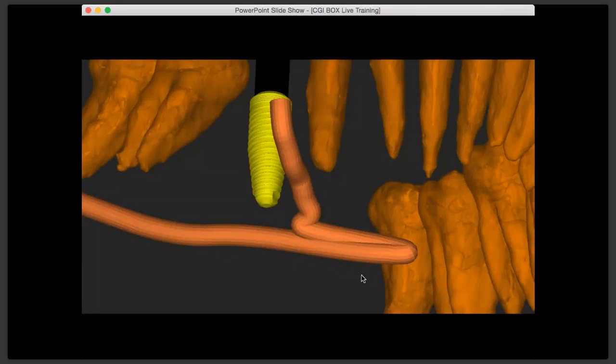Now you can study the site, you can study the anatomy. You can see that this patient has an anterior loop of the inferior alveolar nerve. Okay, so here's the IAN traveling in the jaw from a coronal position to apical position, passes the mental foramen, moves forward and loops back, and can loop back up to a good 5 millimeters, around that average, but it can be more.